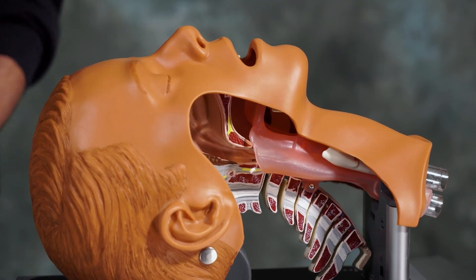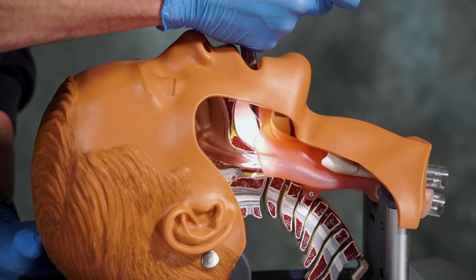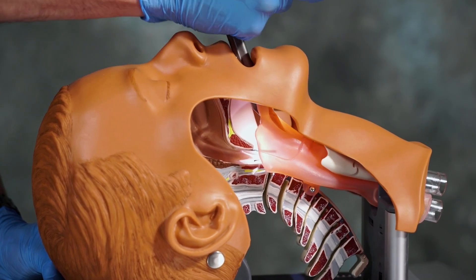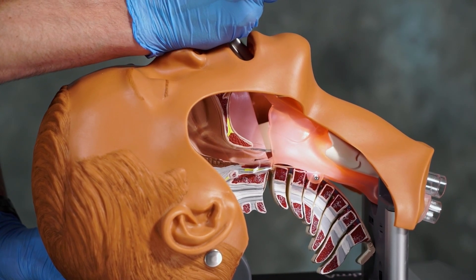With the Miller blade, note that we insert a little bit farther than the Macintosh. As we go down, we're going to visualize the epiglottis, go past the epiglottis, and once we're past it, lift directly up, visualizing the vocal cords.